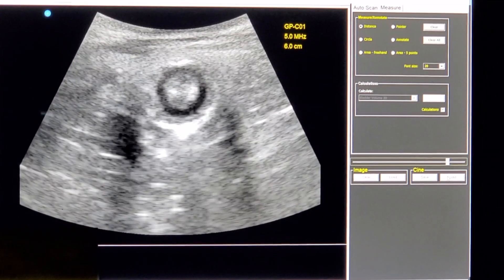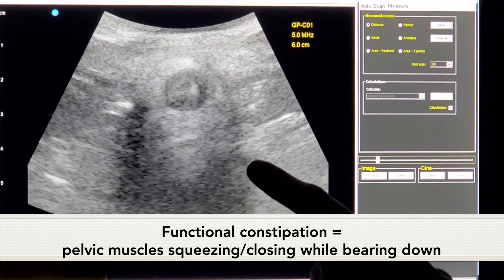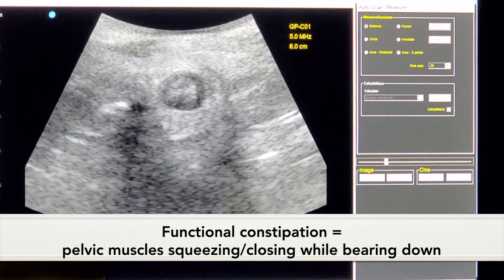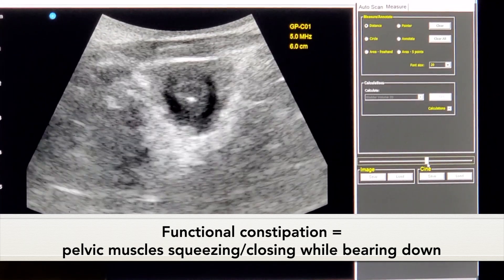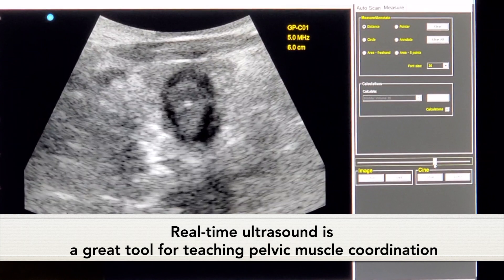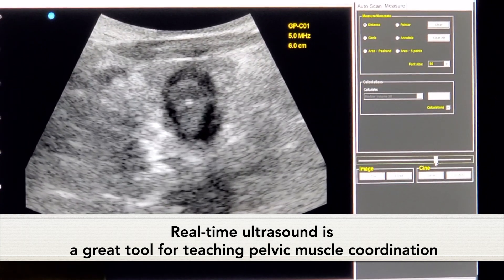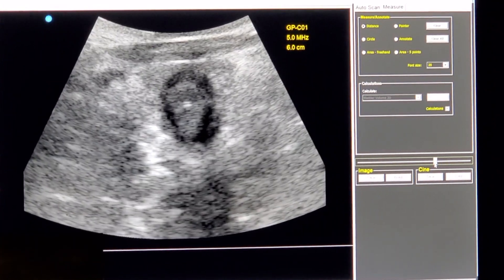What we end up seeing a lot with functional constipation is we actually see this squeezing and closing when a person is bearing down, instead of this opening and dilating. So this is a great tool to help teach patients what they're doing with their pelvic muscles, and they watch it with us so we can teach them proper coordination to help reduce their symptoms.